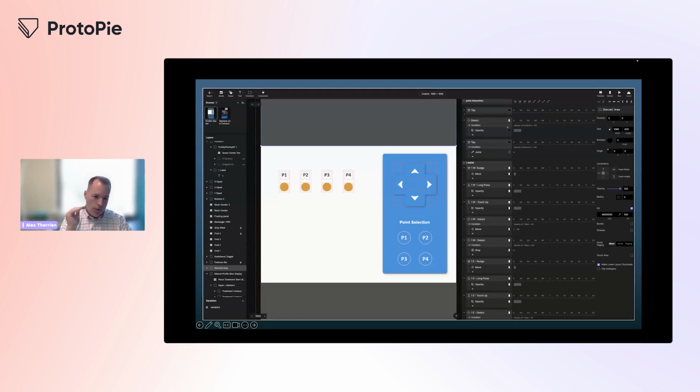So one tap moves an increment, but we also wanted a long touch in the D-pad to move as a repeat move. The nudge and touch features obviously are going to interfere with each other because they're using the same sense. I'm either touching down, I'm tapping, it's the same input. The build style that I just described to you allowed us to identify where those conflicts were happening as we're going through trying to figure out what the right approach was.